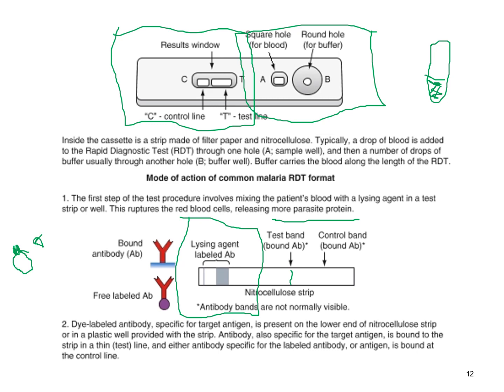They're there. And then you also have an antibody specific labeled antigen or antibody, just depending on what this control band line uses here. That will be here. Again, you can't see it. You're not going to see it until it's activated once these solutions and patient samples are put in.